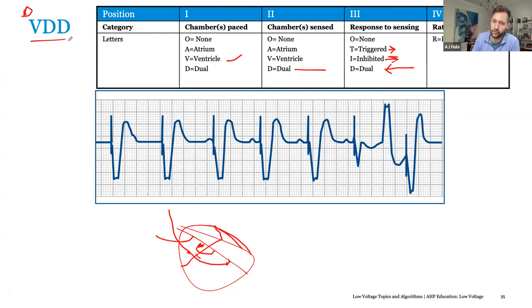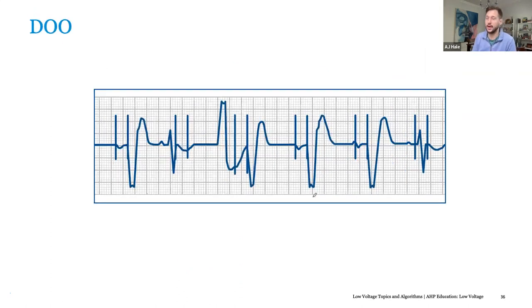I only know one physician who really uses them up here in Boston. Didn't really know anyone in St. Louis who used them at all, but this is something you may see. Another thing is you can actually program a device with two leads to VDD as well. There's really not a good reason to do that, you might as well just do DDD in most cases. But it may occur, so if you ever come across it, that's what it's for.